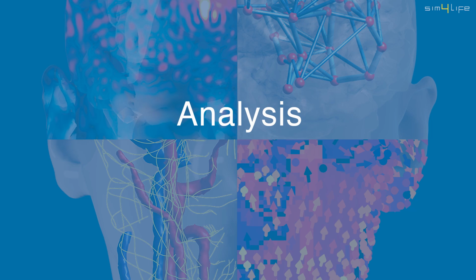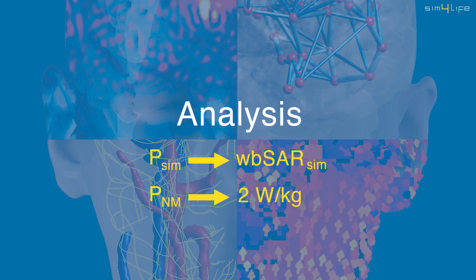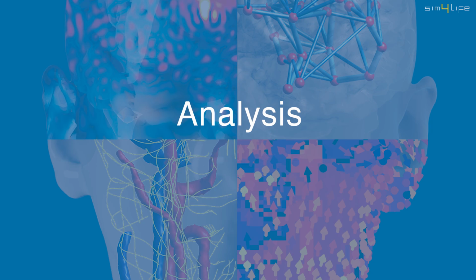First, we consider the power deposited in the simulation, which corresponds to the whole body SAR calculated during our analysis. Name it PSIM. To ensure that our results comply with the safety limits for the normal operating mode, we need to scale this power value appropriately. To do this, we compare the calculated whole body SAR from the simulation with the SAR limit, which is 2 watts per kilogram. We scale the PSIM to reflect what the deposited power would be under the normal operating mode safety limit.